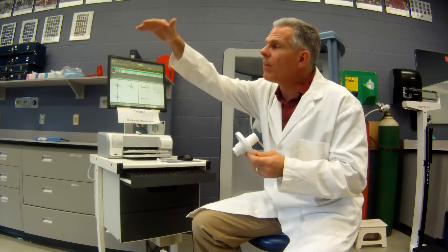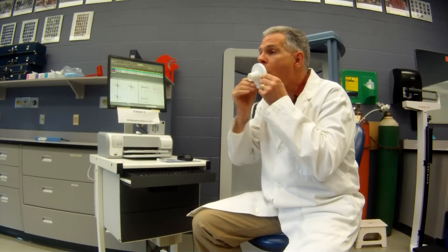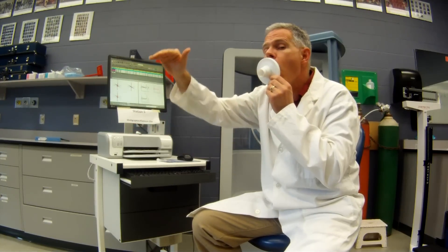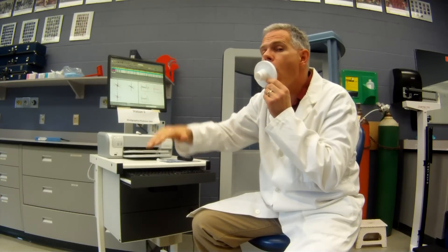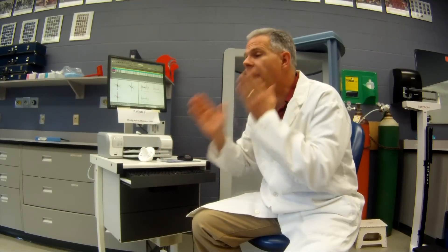You actually want their breathing about one per second. If I bring my hand up or down a little bit, that means I want them to take bigger breaths. If I go like this, I want them to take a little bit smaller breaths. So about one breath per second - nice, even panting. To help with that, have your hands on your cheeks and I'm going to time it for you using my hands.